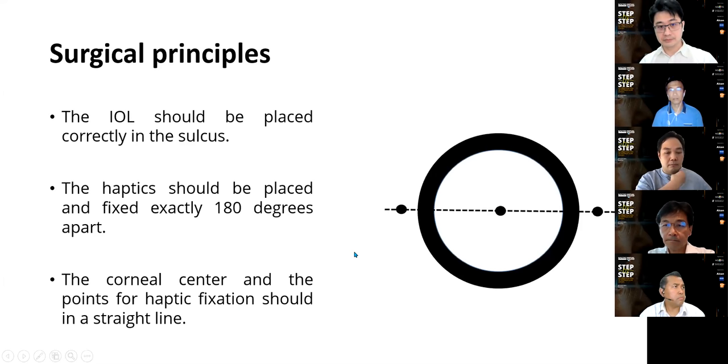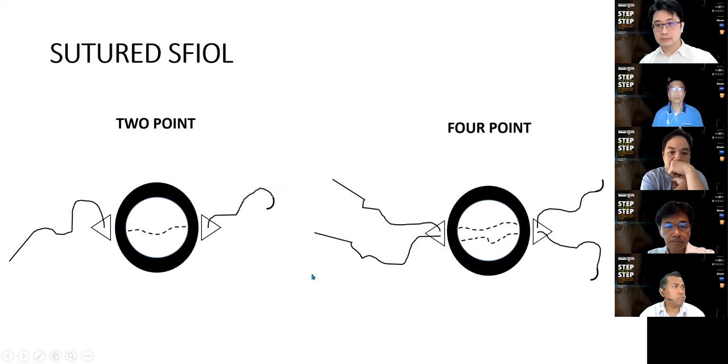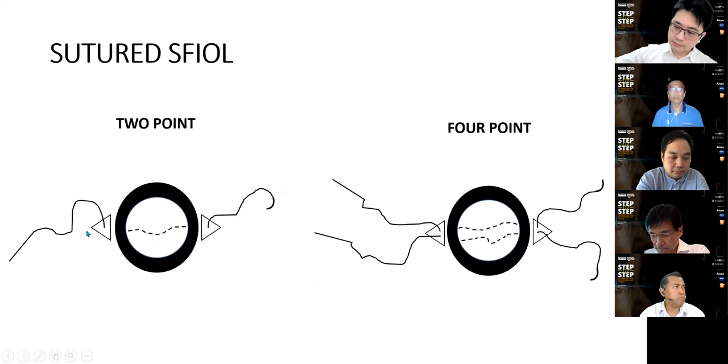Now let's go to my sutured scleral fixation. It can be done in two ways. One is 2-point fixation and the other one is 4-point fixation. The 2-point fixation is where you use a single thread, a single suture material. Normally we use a non-degradable material, which is Prolene. With a straight needle on one end and a curved needle on the other end, pass it through and through by the docking method, externalize this part of the suture, cut it and suture it to the eyelet of the IOL.